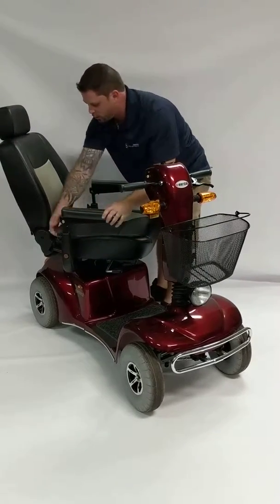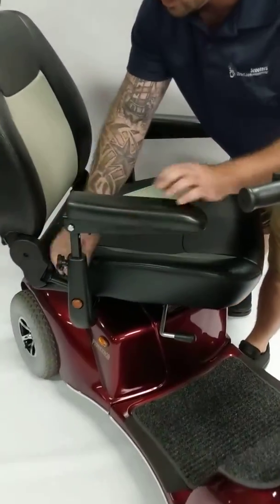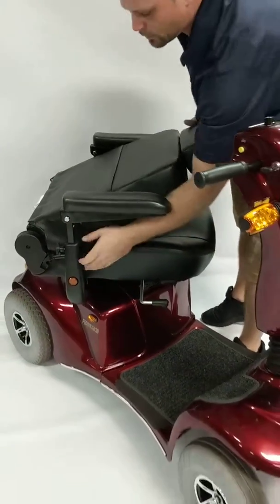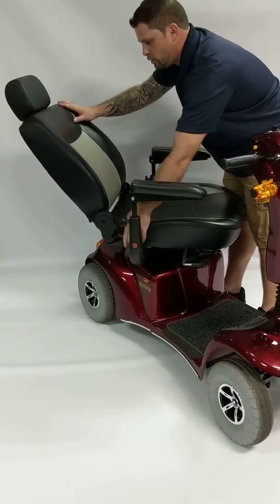To give you a better look here, you can adjust the height. You can also recline the seat. You can fold forward and you can also go back pretty far, wherever you want and in between.